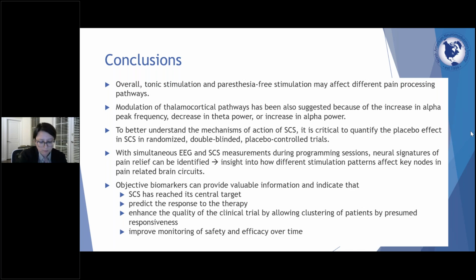So in conclusion, overall tonic stimulation and the paresthesia-free stimulation waveforms may affect different pain processing pathways. Long story short, to better understand the network dynamics and the role of neural circuits in the perception of pain and the pain relief in response to SCS, we need better biomarkers. We need more studies exploring the electrophysiology underlying the stimulation. We need more studies showing different responses to different SCS parameters, and we need studies including well-designed experiments, which include placebo effect. And thanks so much.